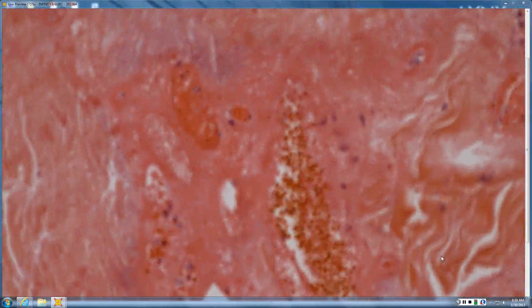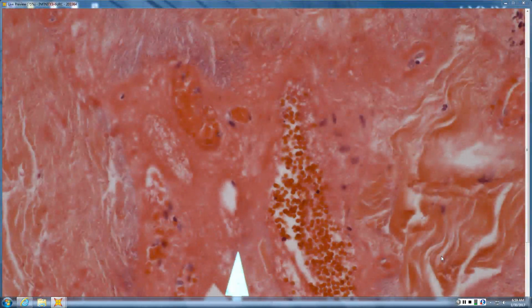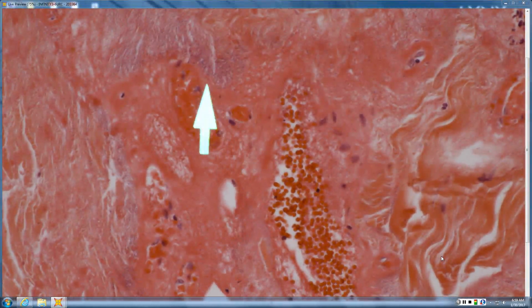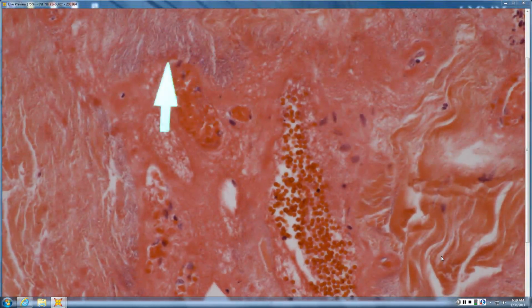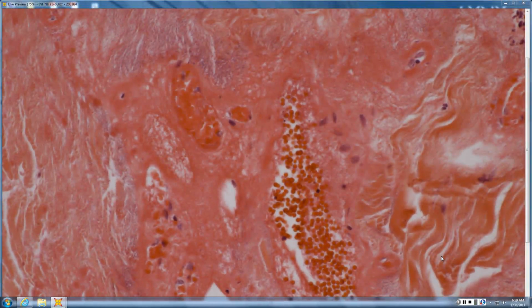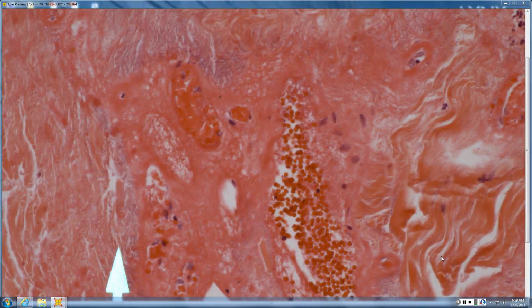I mean, they're almost hard to see because they're not well defined, because they're so necrotic. So from the necrosis, they're kind of dying off, and they don't look like obvious vessels. But these vessels here are turning into that pink schmoo, that homogeneous appearance. These are all necrotic. And then right around the vessels, you see this very faint, sometimes hard to see, kind of blue haze. And all those are the organisms.